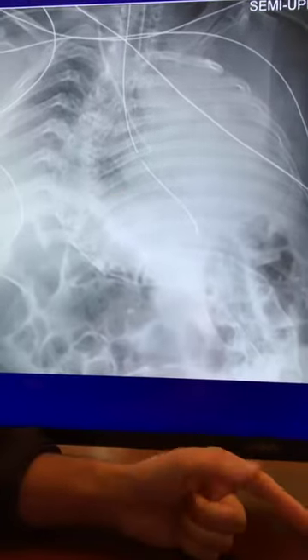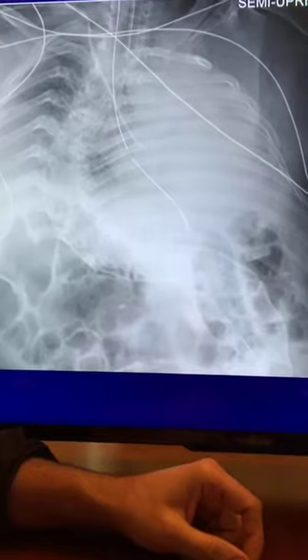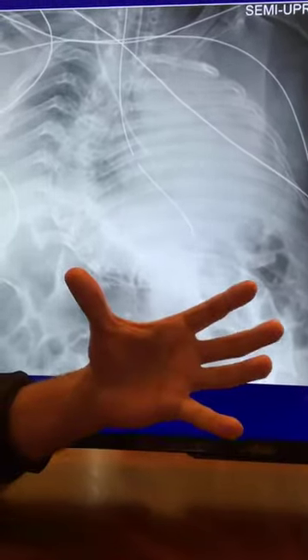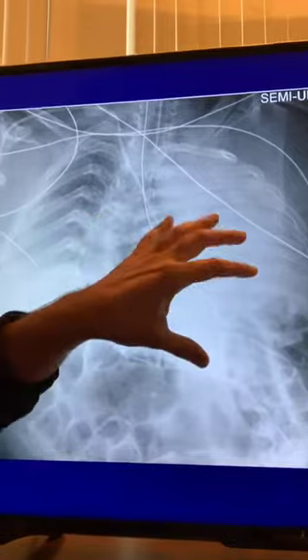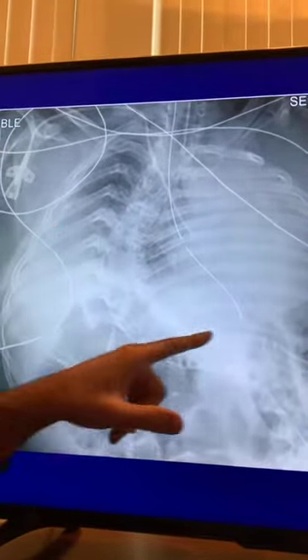And then you can ask me, well, is there a pleural effusion in there? Yeah, there might be. Can I tell for sure? Not really. There may be a little bit. I know it's not a big old pleural effusion like we've talked about before, when I talked about the lung whiteout of complete lung collapse versus complete filling up with fluid, right? It's not one of those instances. But yes, there may be an effusion hiding down in there somewhere. Mainly though, it's a heart with a lot of atelectatic lung on the scoliotic patient.